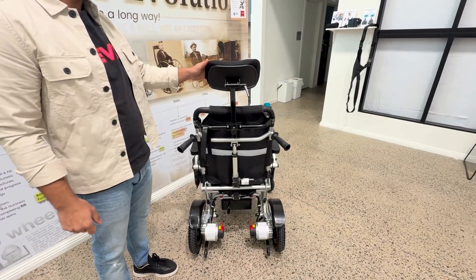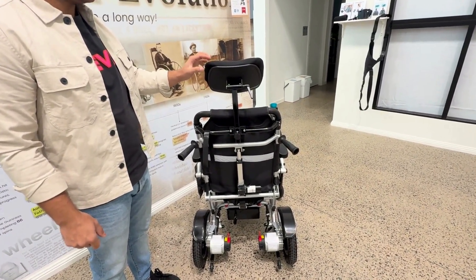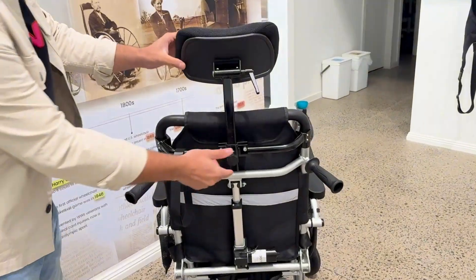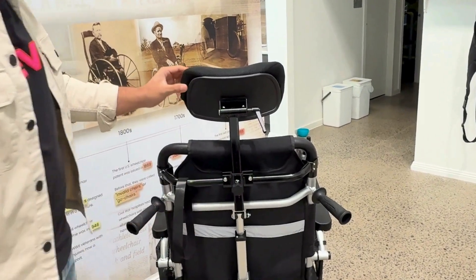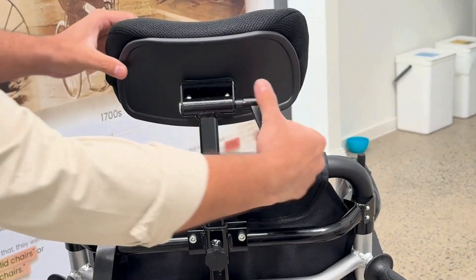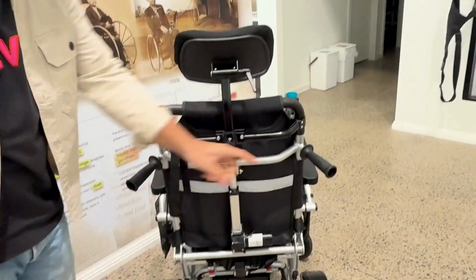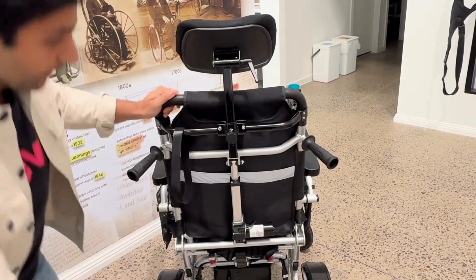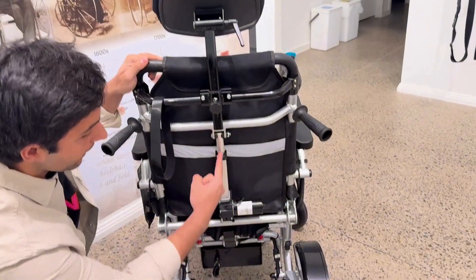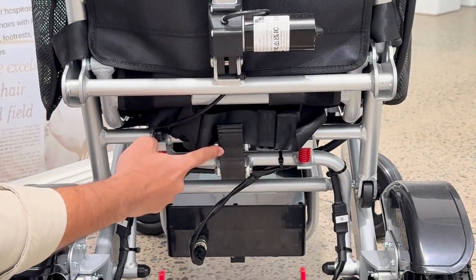Talking about the structure of this wheelchair, starting from the rear side: this is the headrest and you can adjust the height of this headrest using this grip. You can also adjust the angle using this lever. It comes with two handles which are used to push this wheelchair manually. This is the automatic reclining mechanism.